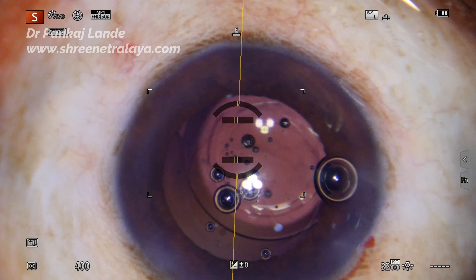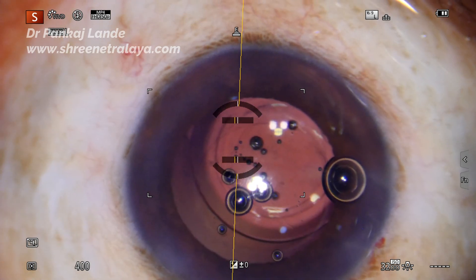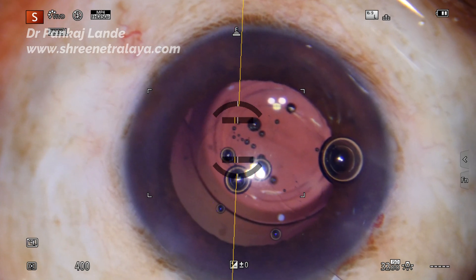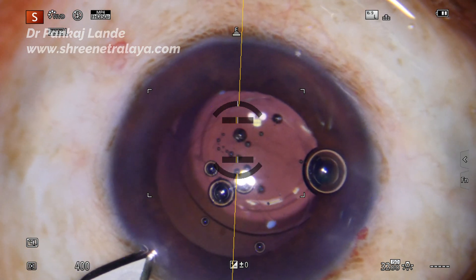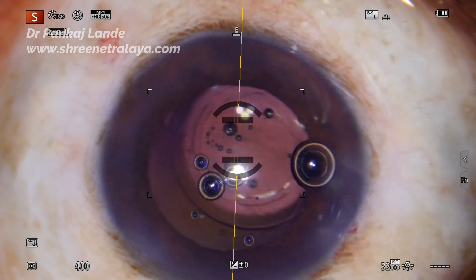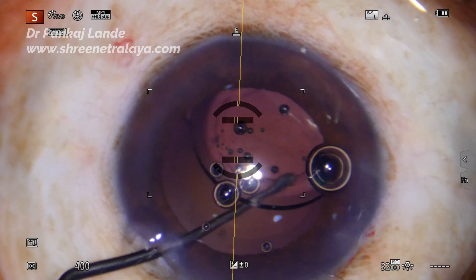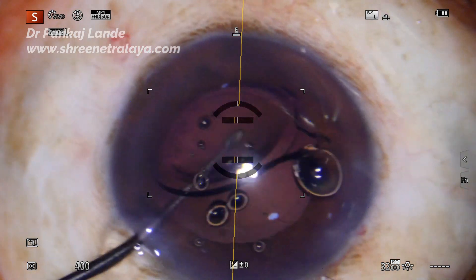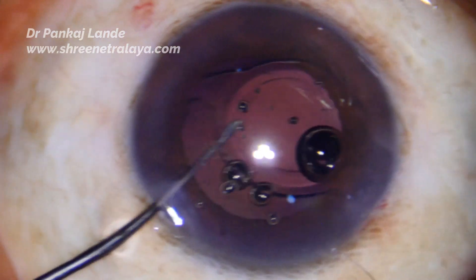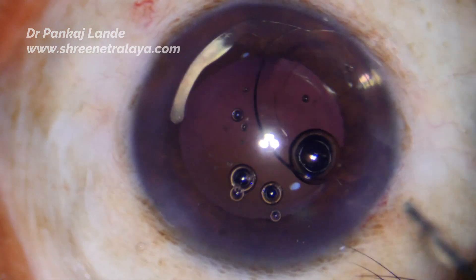Myself and the patient were thinking what to do, and the patient was moving his eyes too much. So I filled up the anterior chamber with viscoelastic and some amount of visco behind the IOL to push the posterior capsule back. My side port is usually 23 gauge so I extended it a bit so I can introduce my micro scissor forceps. In such scenarios I don't use a sharp instrument — I am using an IOL manipulator with a blunt tip to dial the IOL into the anterior chamber safely.